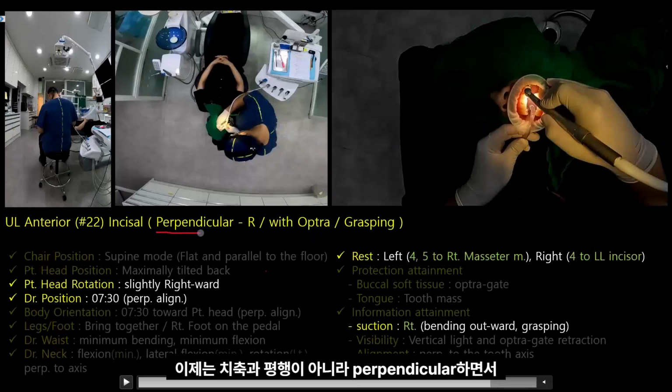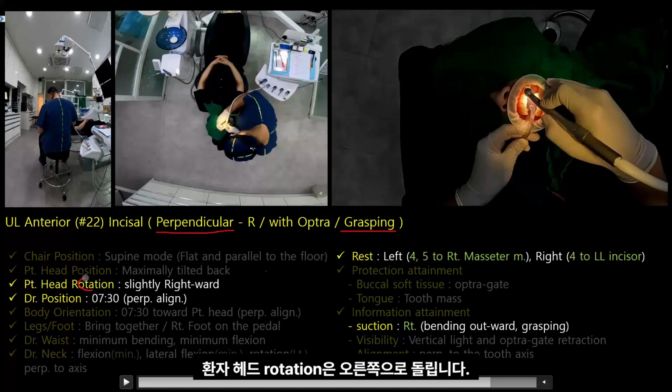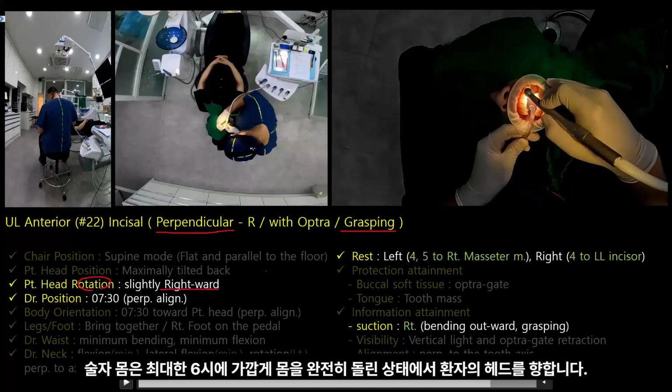Now, I will introduce the position of the suction tip where it grasps or holds in a mode that is perpendicular to the tooth axis rather than parallel to it. The patient's head should be rotated towards the right side. The operator's body should be fully rotated, aiming towards the patient's head, positioning themselves as close as possible to the 6 o'clock mark, directly facing the patient's head.